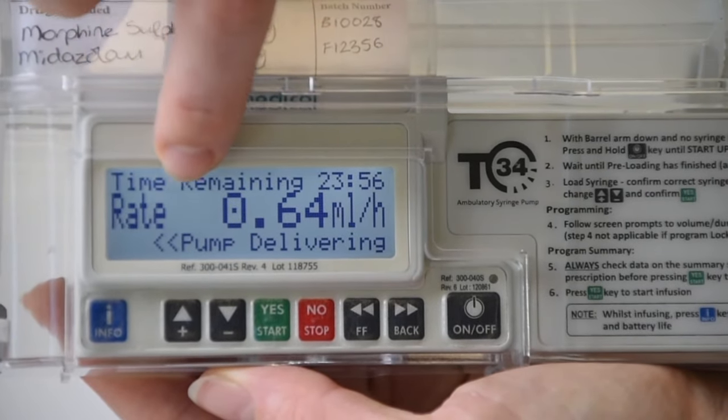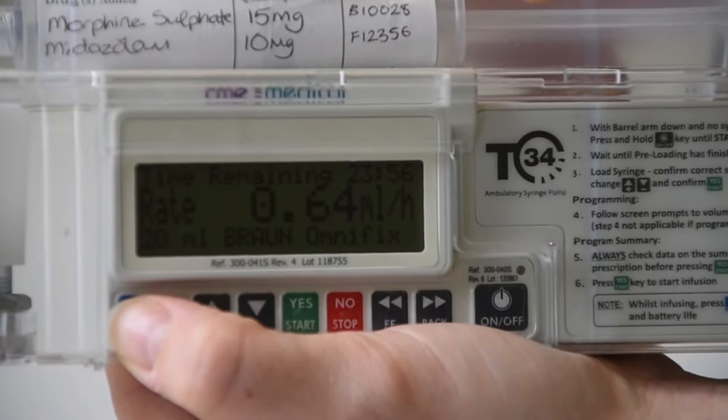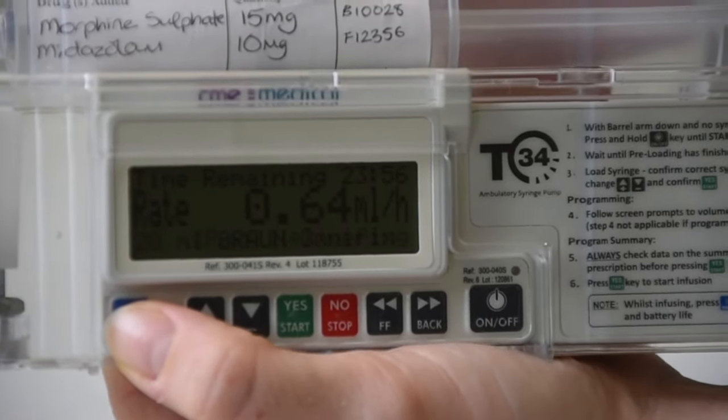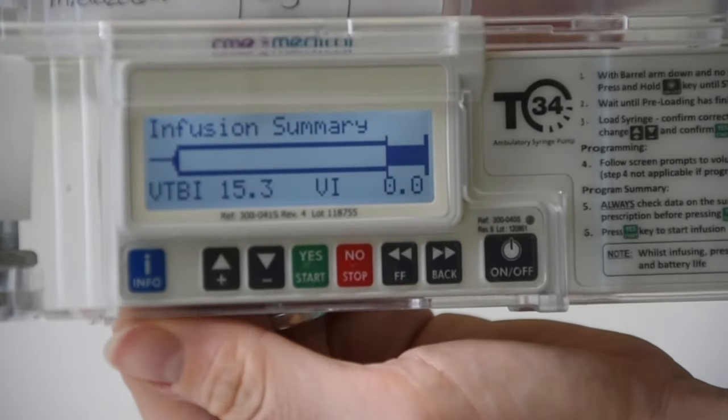For 4 hourly checks, you will find the infusion rate and time remaining on the main screen. And to check the battery level and volume remaining and volume infused, press the info button twice.